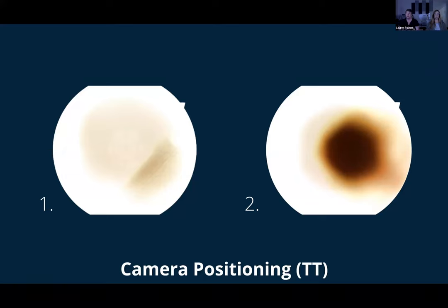My joke about the tabletop camera is the hardest part about using it is ensuring that your patient is properly positioned. So typically camera positioning opportunities with a tabletop are directly correlated to patient positioning opportunities. Your patient is not correctly situated in the camera, and therefore it is causing those images to show up looking washed out, or they're having shadows that are clearly not dilation shadows. So these are two key examples that we often see when patients are not correctly positioned.